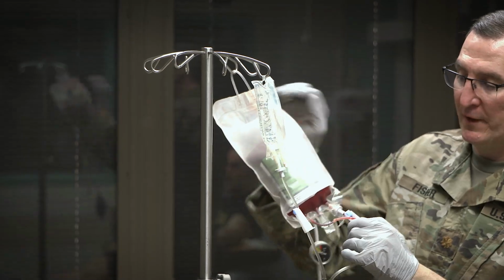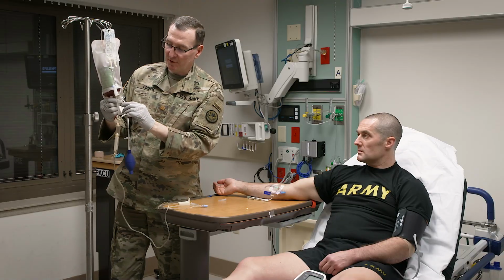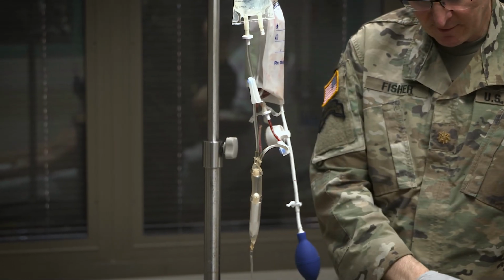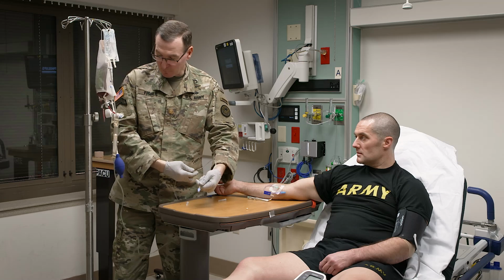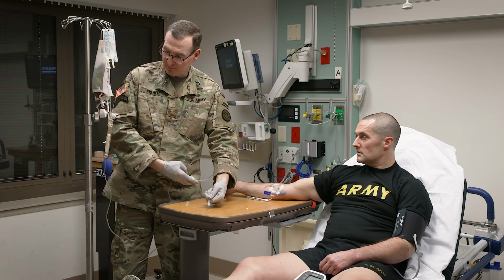All right, I'm going to now turn the one on the blood. I'm going to roll it down so it can run. I'm going to go ahead and see if I can turn this bottom one on just to make sure it flows.